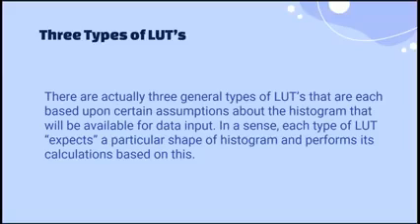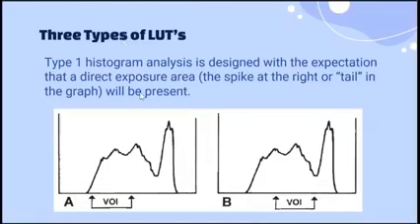The next LUT is the preset, which is already installed in the computer and must be followed. So the first LUT should follow the second LUT, which is the preset, so that processing errors will not occur and the quality of the image is better. This is the first type of the LUT.